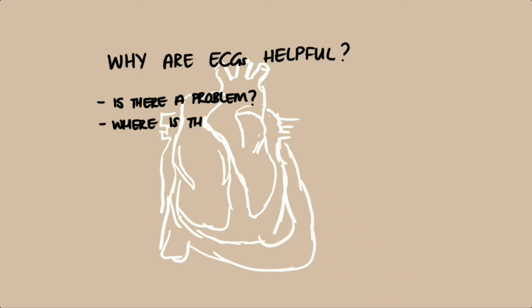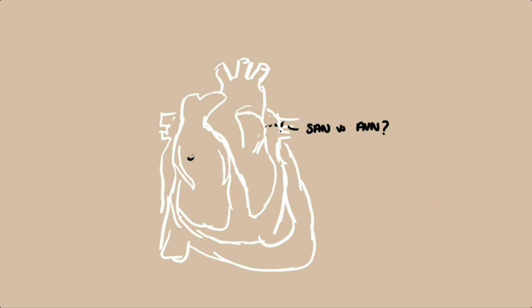So ECGs are helpful because they help you detect problems and tell you where the problem is, both in terms of maybe what artery or even which part of the conduction system.